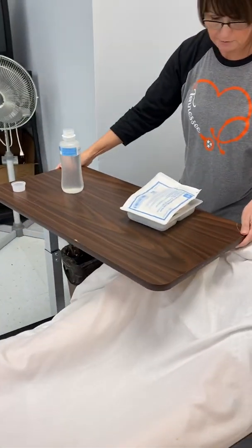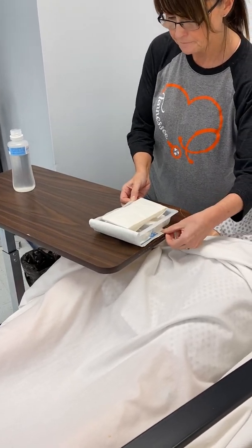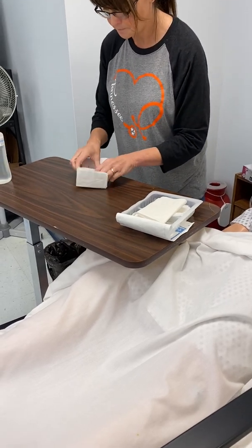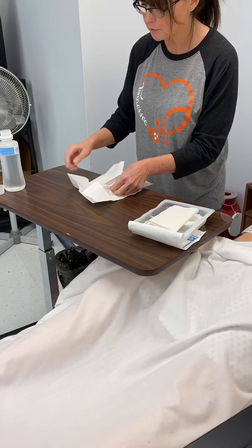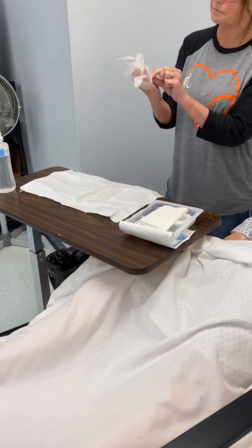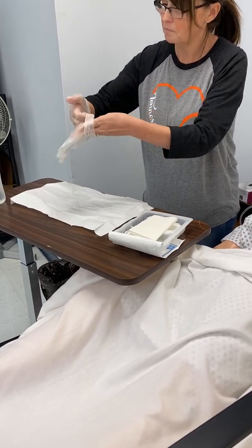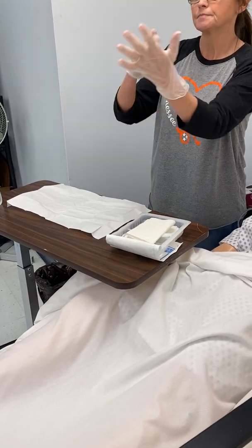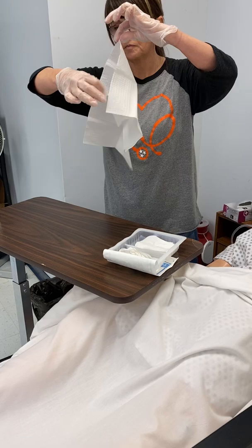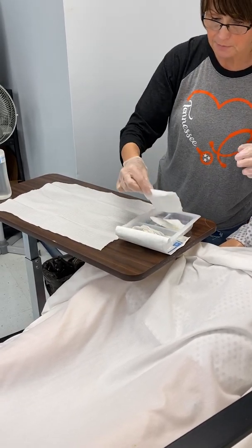Open the saline. It's still good. Again, I'm going to put my table here so I can reach it better. I'm going to open this away from me. I've got my table cleared off because it's going to make it a lot easier to do with a table that's cleared off. Okay. Side down. I'm going to get all of my stuff out.